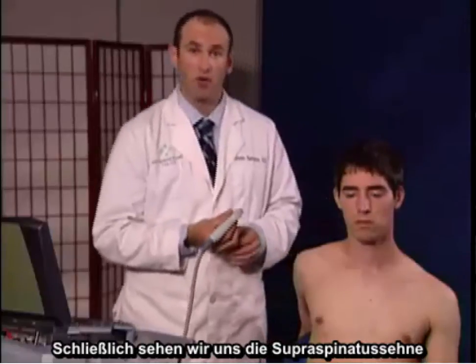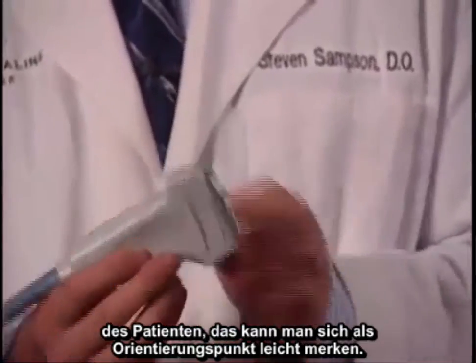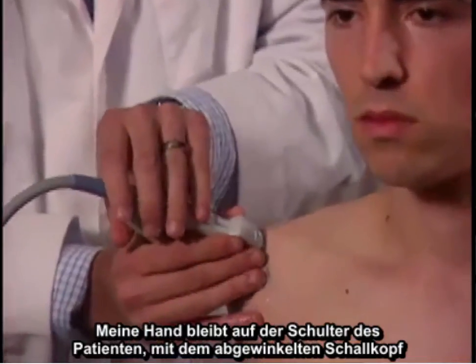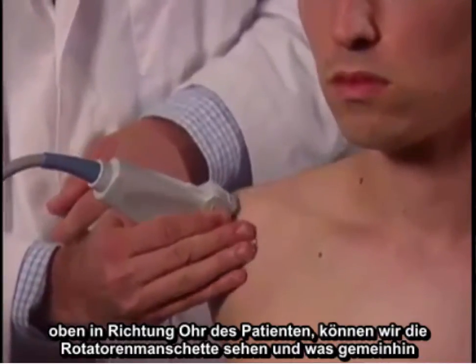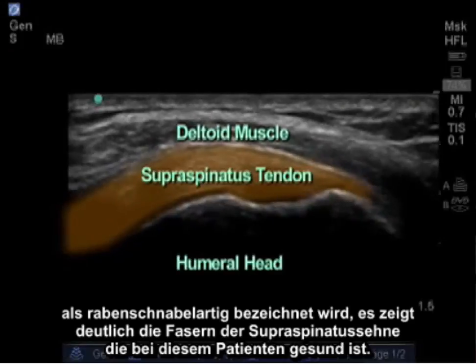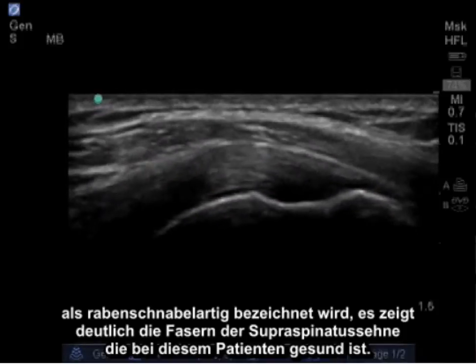Lastly, we're going to look at the supraspinatus tendon in its longitudinal view. I place the notch of the probe facing towards the patient's ear, which is an easy to remember landmark. Maintaining contact with my hand on the patient's shoulder, with the probe angled up towards the patient's ear, we can see the rotator cuff in what's commonly referred to as a bird beak type image, clearly seeing the fibers of the supraspinatus tendon, which are healthy in this patient.